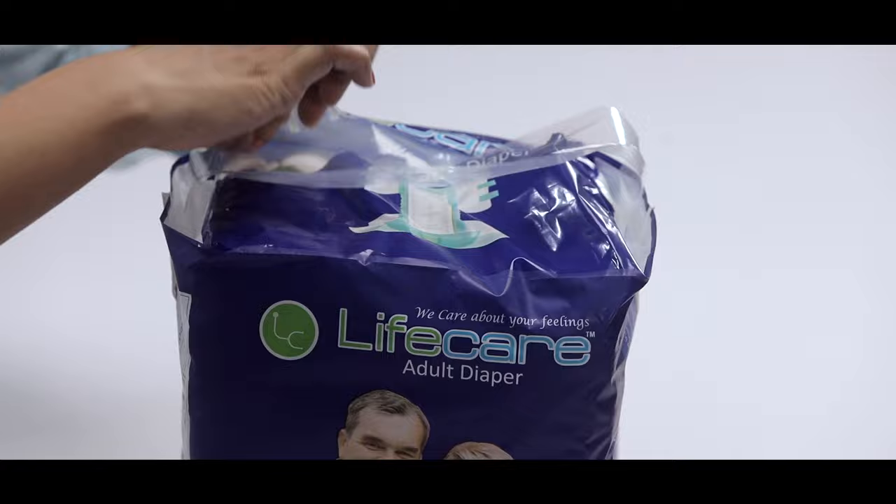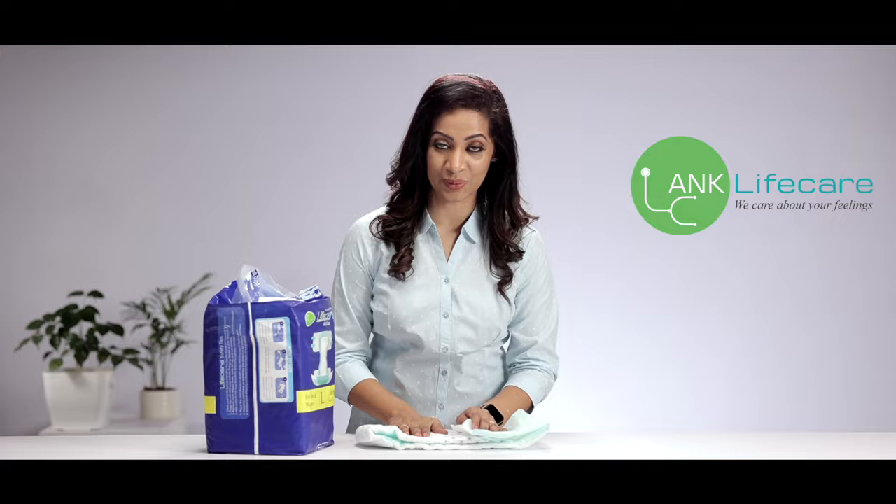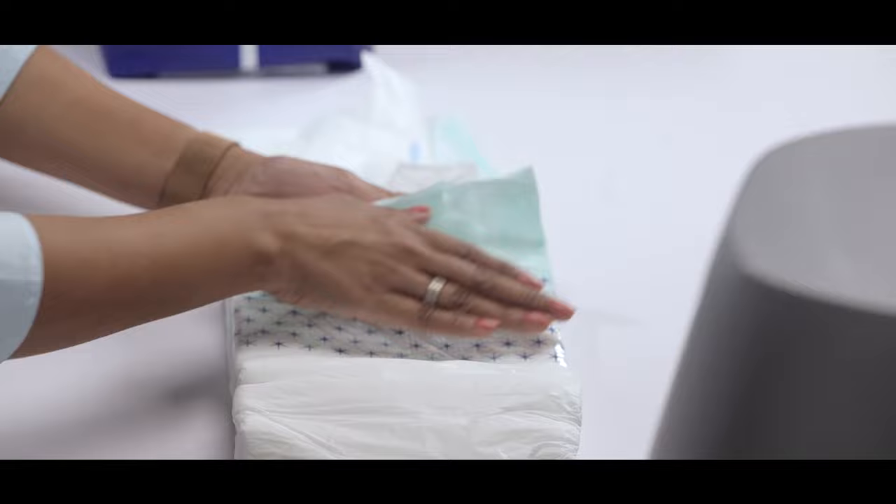You can just rip along the indication given on the packet, and when you remove it you can easily pull out the adult diaper. It has a super absorbent gel and is very easy to use. Once you've taken the diaper out, you need to pay attention to all the parts of the diaper.